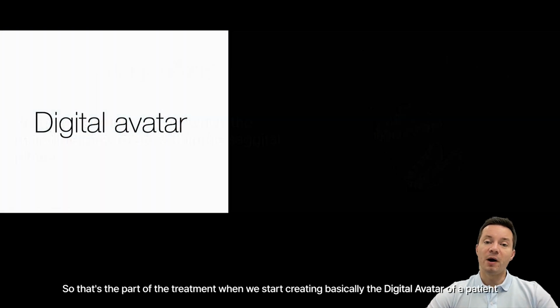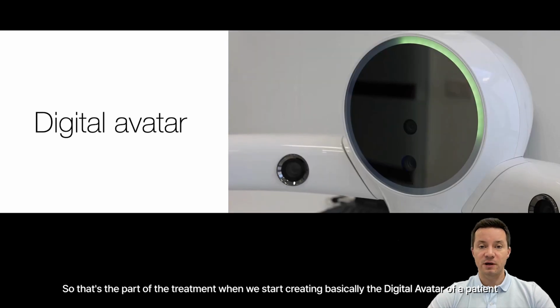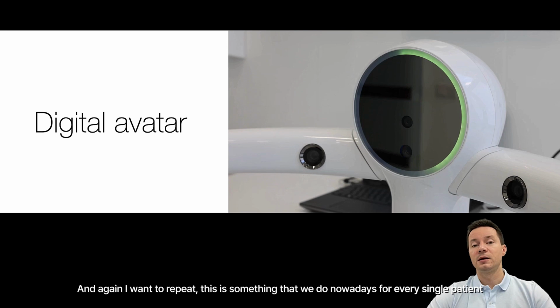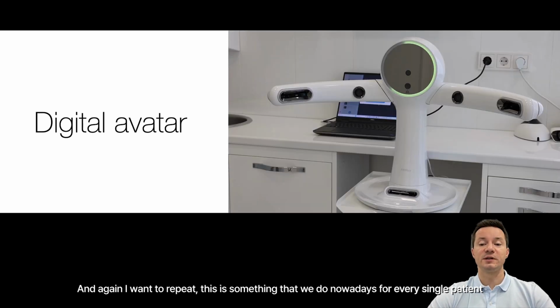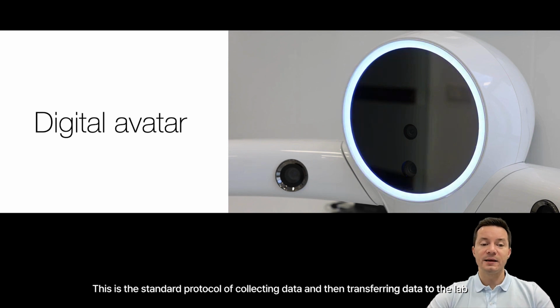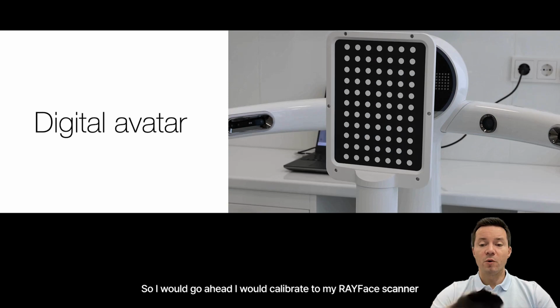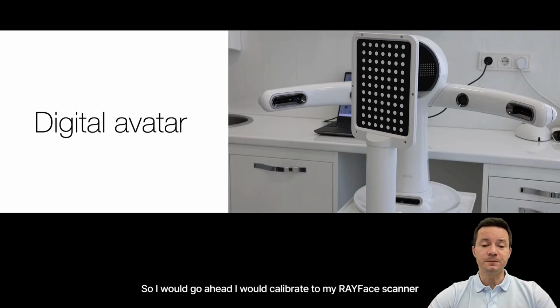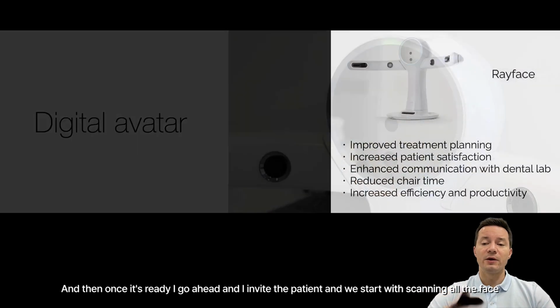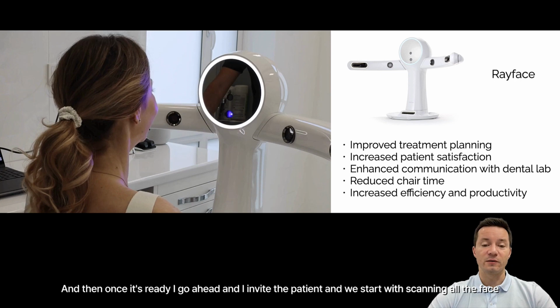So that's the part of the treatment when we start creating basically the digital avatar of a patient. And again, I want to repeat, this is something that we do nowadays for every single patient. This is a standard protocol of collecting data and then transferring data to the lab. So I would go ahead, I would calibrate my Ray Face scanner, and then once it's ready, I invite the patient, and we start with the scanning of the face.